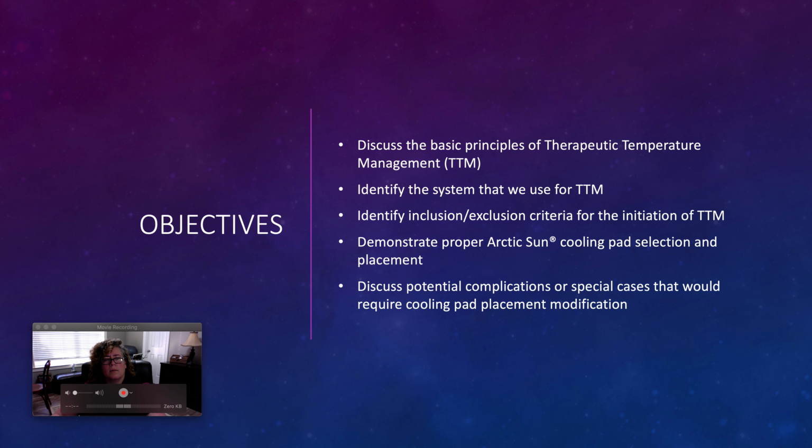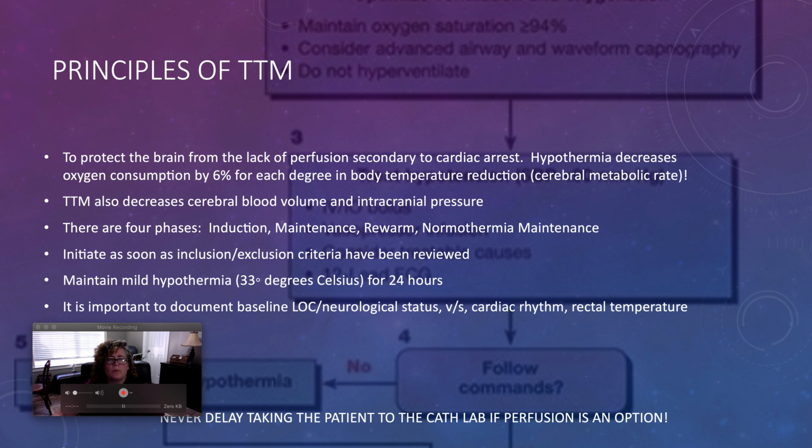And then we will follow up with the student actually going to a simulation lab, pulling out the pads and placing the pads on the patient, and describing different scenarios and what they would do as far as inclusion exclusion criteria. Some basic principles of TTM.